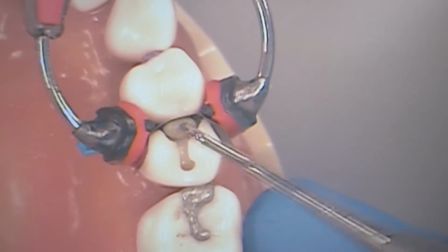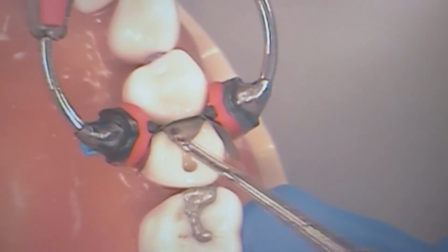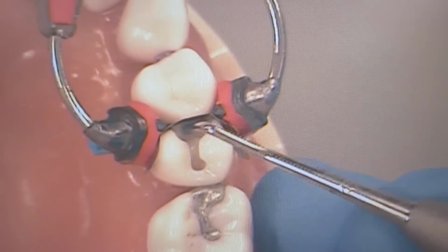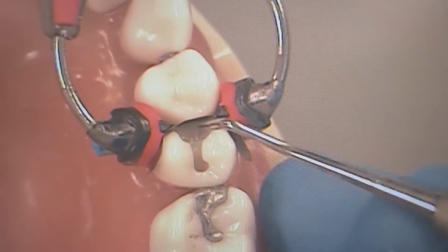Applying the second layer now. And I'm packing up to the pulpal floor, and making this layer nice and smooth.